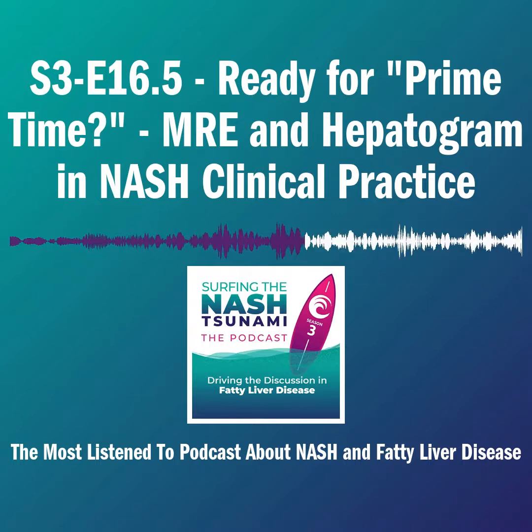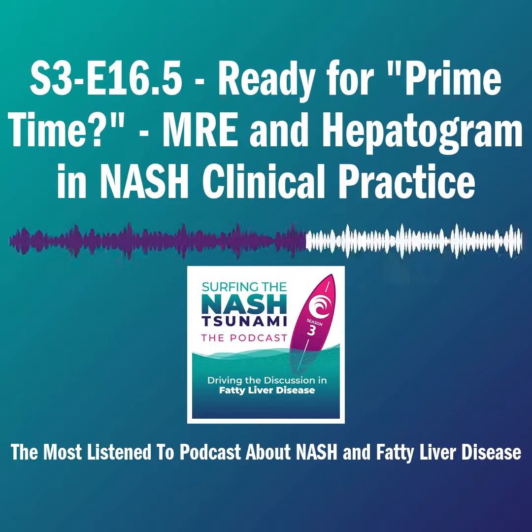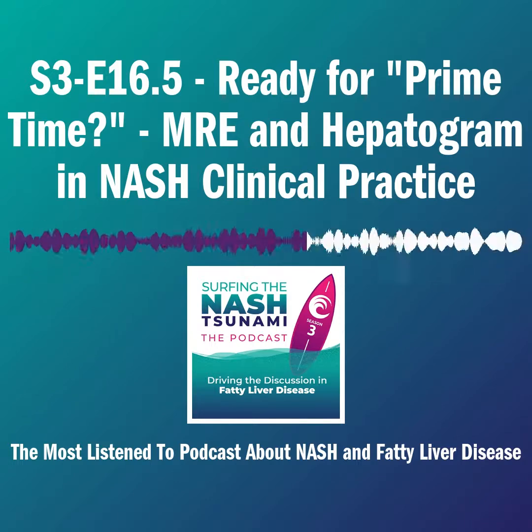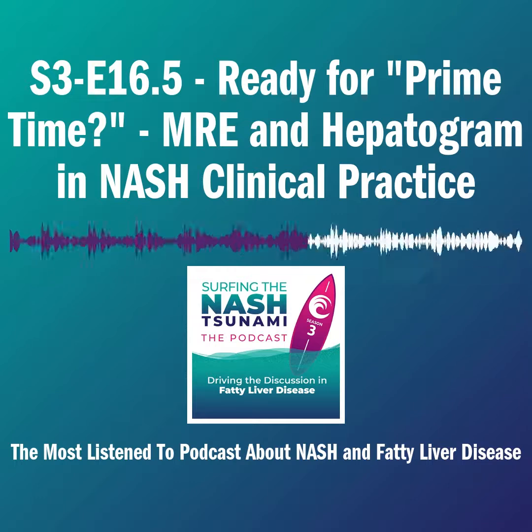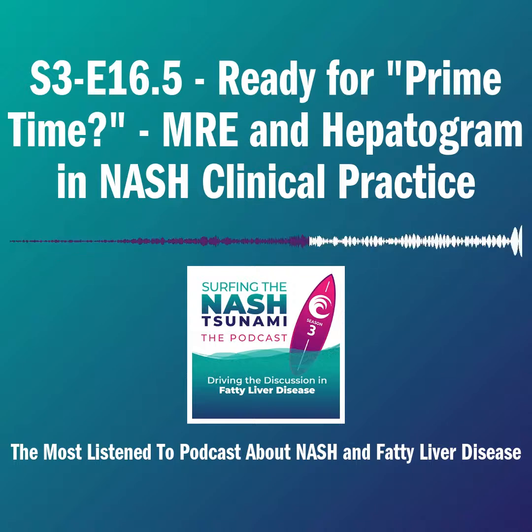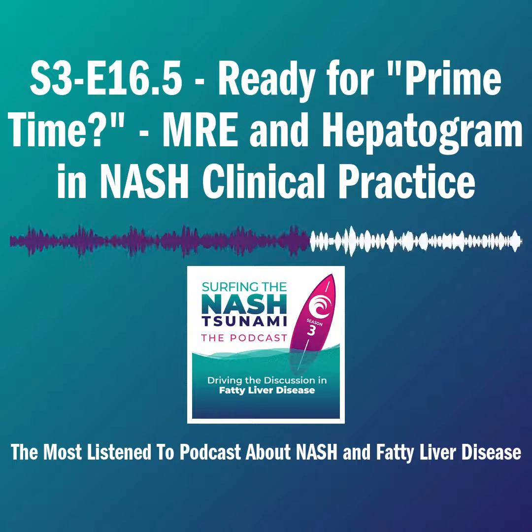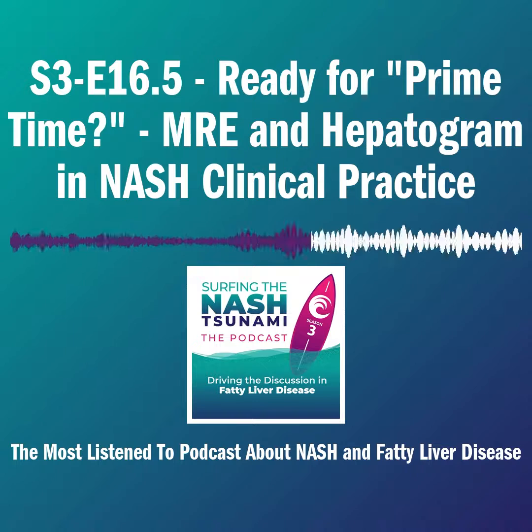Sounds mysterious and vague, I know, but there should be an adjustment for change in liver volume with the changes on MRE. I don't know what's the exact secret recipe, but as you know, there was that concept that if you lose fat, your MRE is getting worse. Some trials, maybe, there were rumors about that. I think it's a proportional thing to the liver volume, and we need someone with Scott and Kay's brains to figure that out, how we can take the volume change into consideration and go beyond that to show the MRE changes.